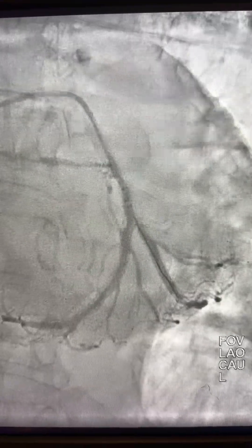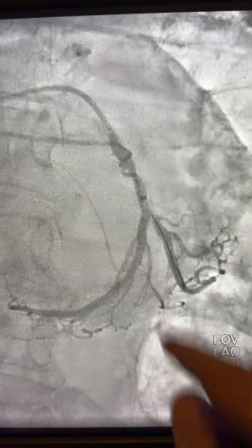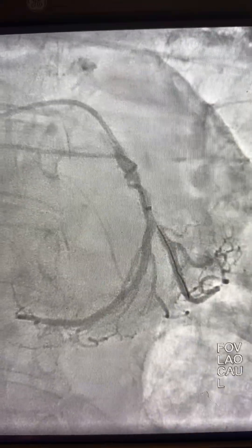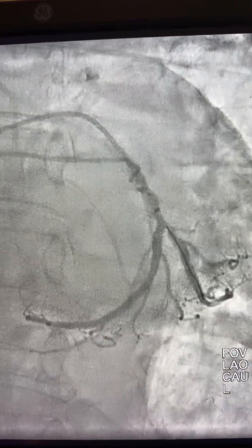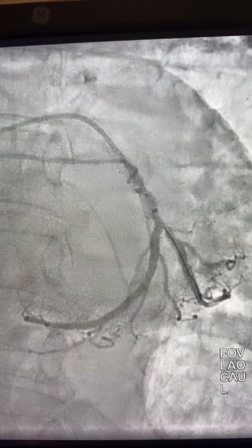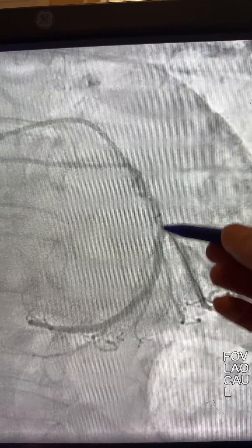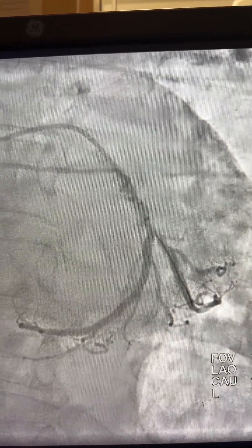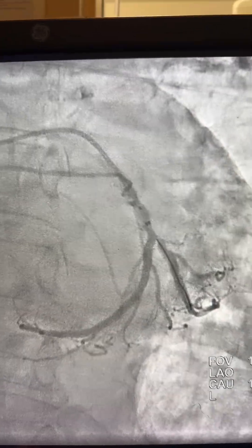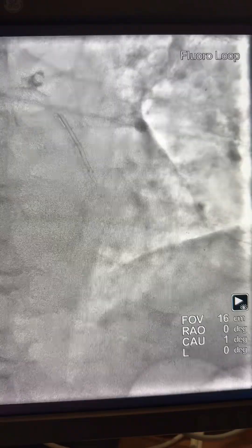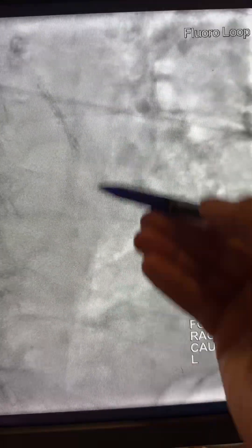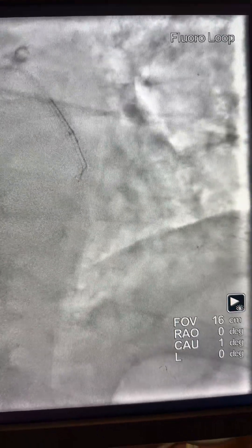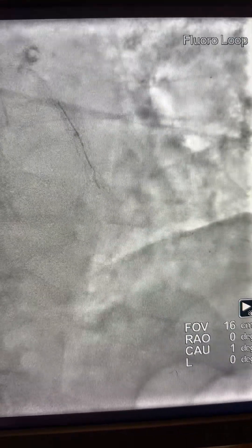Either you leave it alone or try another option. We pulled the wire, kept the guide liner toward the area to support it, but it still won't go through. So we opted to go again and dilate this area with high pressure to dilate the struts, then try again. Here is the NC balloon at high pressure again across that area. We then pulled the balloon and wire and tried through a different route to go through it.